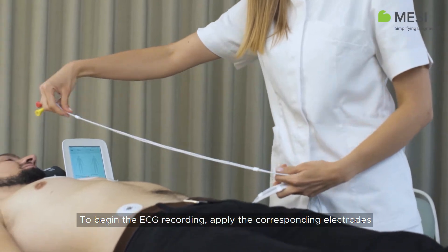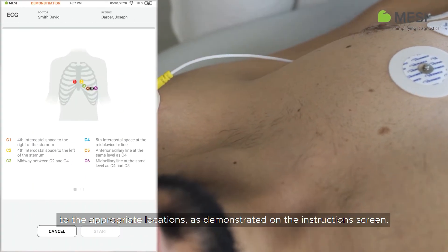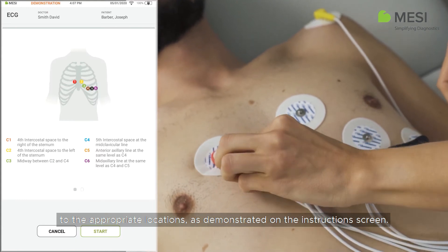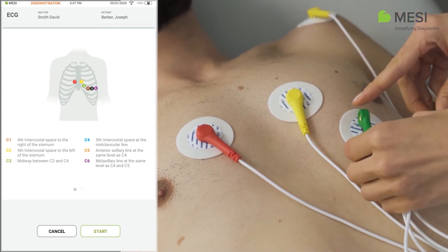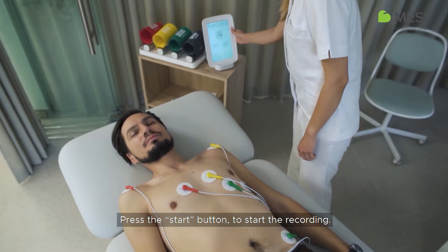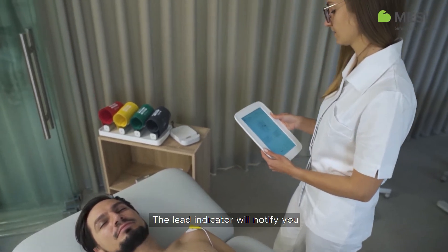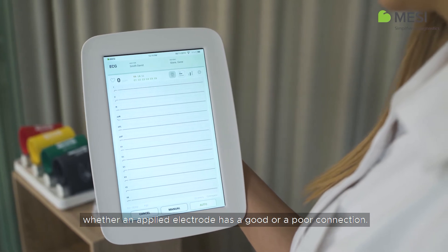To begin the ECG recording, apply the corresponding electrodes to the appropriate locations, as demonstrated on the instruction screen. Make sure to avoid major muscle masses. Press the start button to start the recording. The lead indicator will notify you whether an applied electrode has a good or a poor connection.